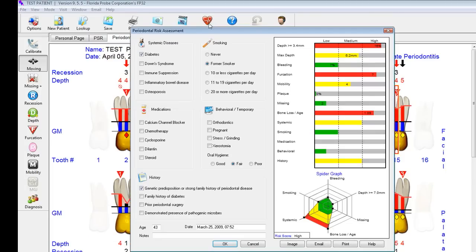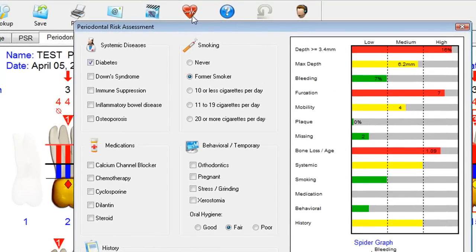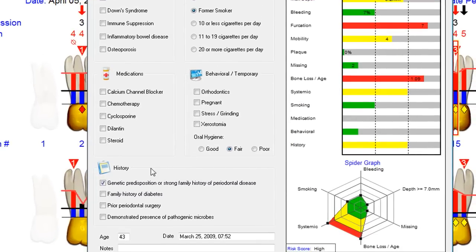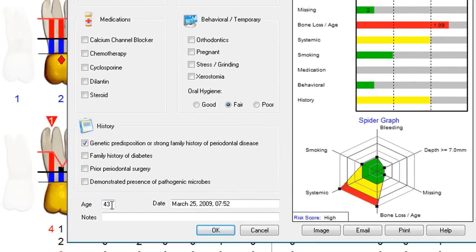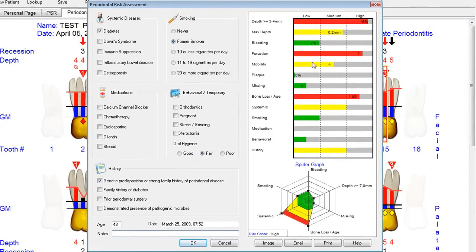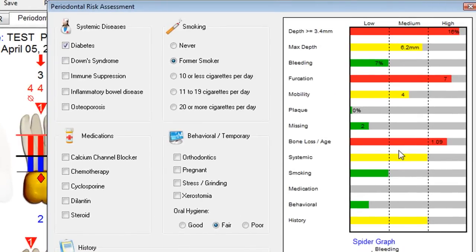Risk assessment is included and is an integral part of the software. It allows you, in a 15 to 30-second questionnaire with the patient, to identify areas of concern that include systemic diseases, smoking, medications, behavioral and temporary issues, as well as history. Age is automatically calculated from the date of birth on the personal page, and the date is automatically calculated from the computer. You can add additional notes such as CRP levels, BANA testing, and other things you're doing in the office.